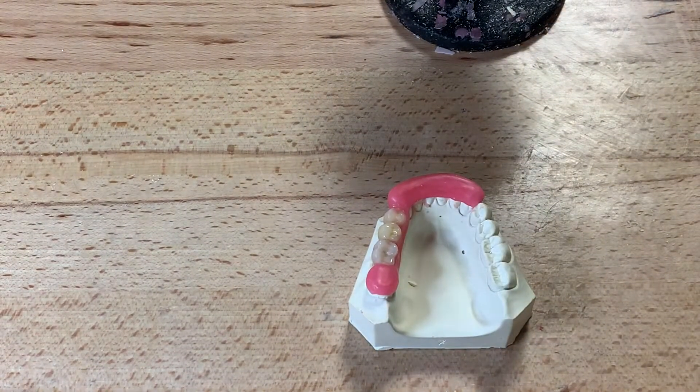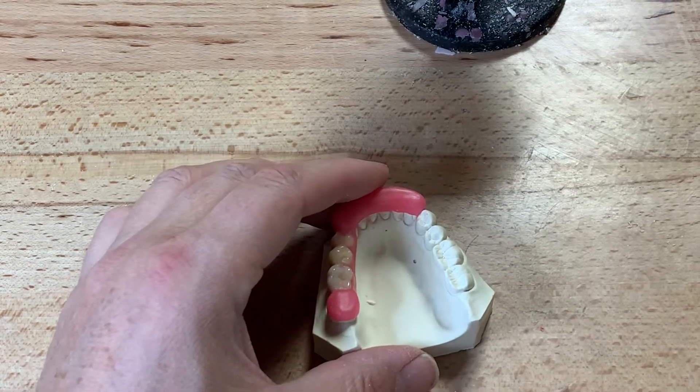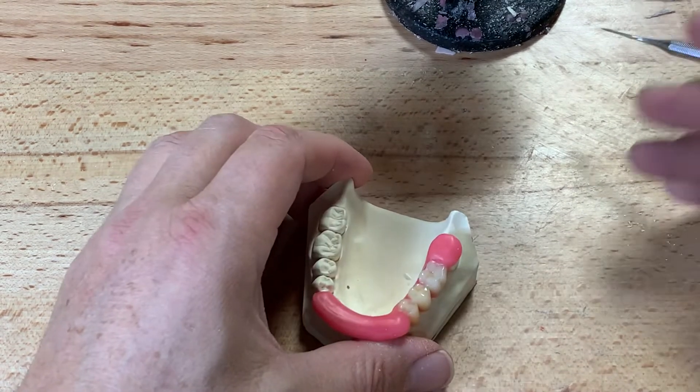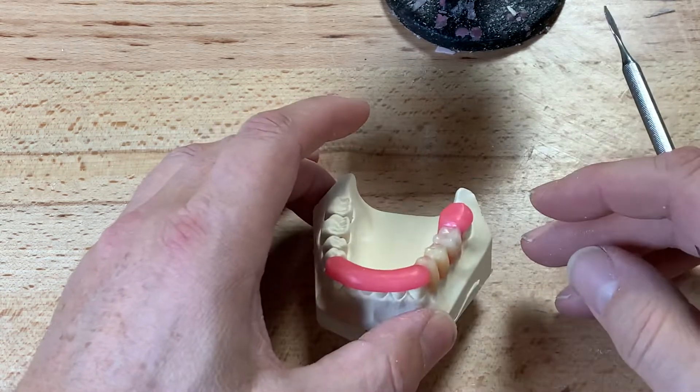In Project 2, Dent 3027, we're going to make a surgical stent for an implant bridge replacing 34, 35, and 36. We're going to have an implant placed optimally for 34 and 36, and 35 will be the pontic.